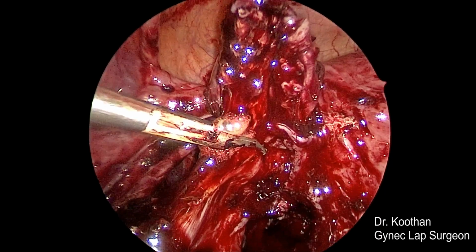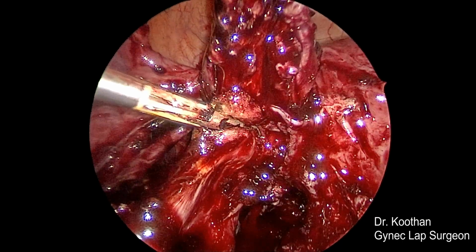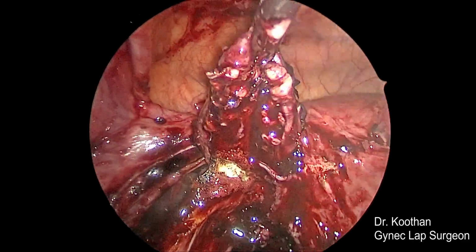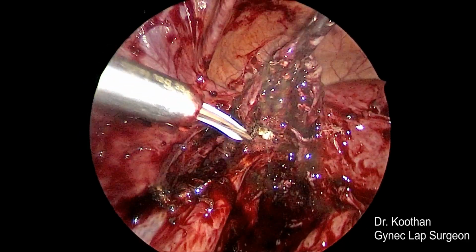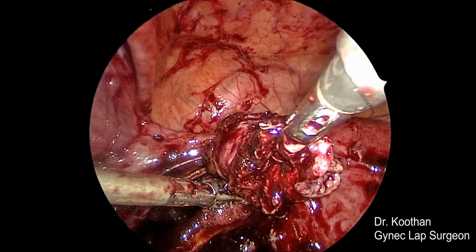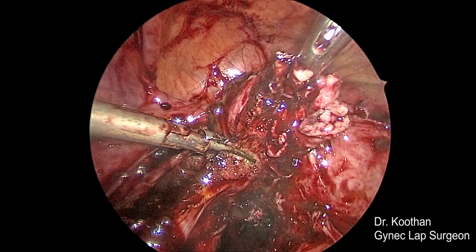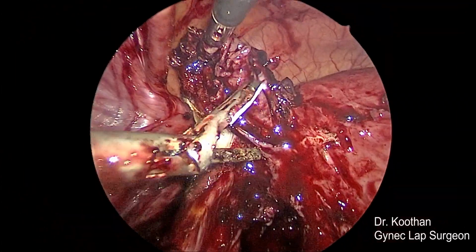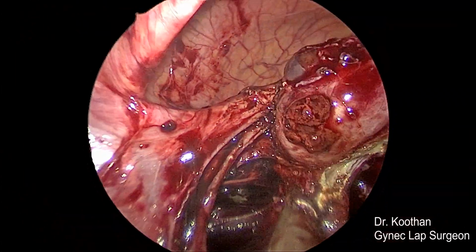Here on the left side, even the endometriotic cyst has got infected, and the cyst was full of pus. So we have proceeded with the oophorectomy on the left side, but on the right side we have preserved the ovary, and surprisingly her AMH was good, and she is for infertility. We have preserved her right ovary. We wanted to preserve the left ovary also, but since it has got infected and the endometriotic cyst has fully converted into pus, we have to take the ovary on the left side.